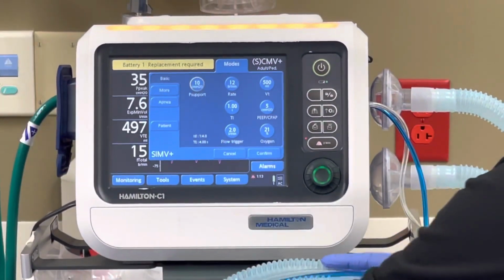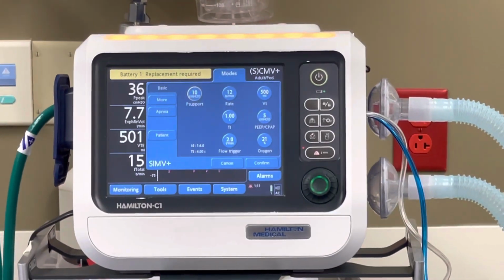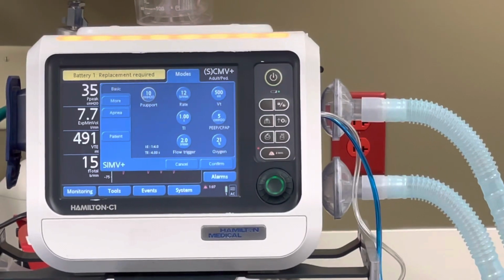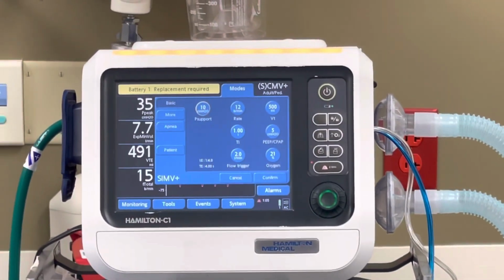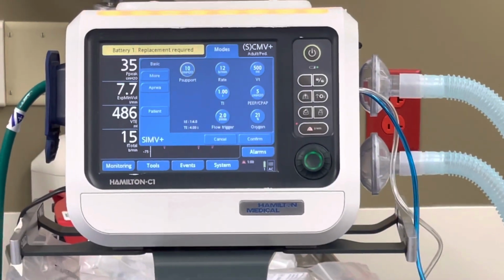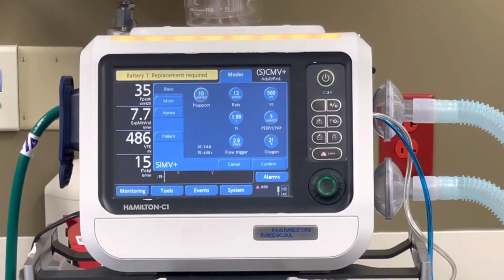What pressure support does is, when the patient takes their own spontaneous breath, it gives it a little boost to compensate for going through the tube. It makes it a little bit easier for the patient to breathe, more like breathing normally versus trying to breathe through a straw. That's what pressure support does.